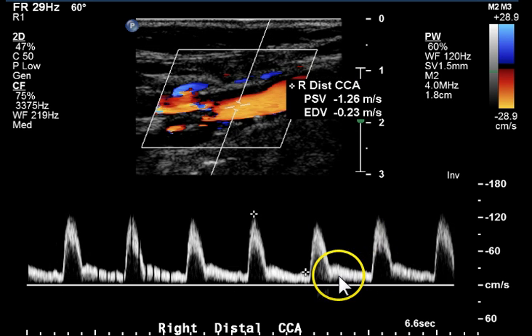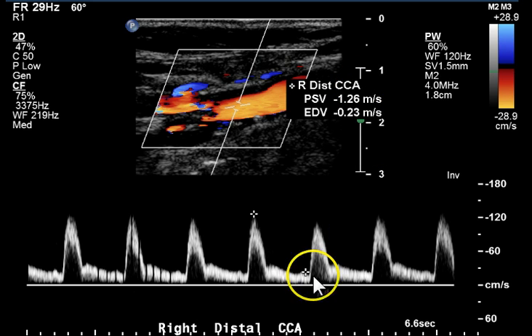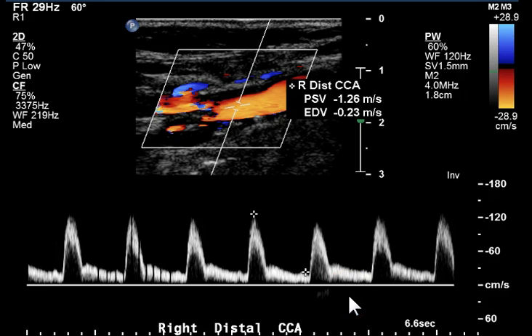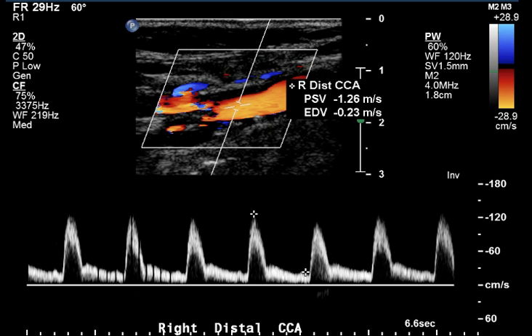Another image of the waveform. In this case, we're seeing a flow velocity of 126 centimeters per second. Remember that the criteria we use for diagnosing disease in the internal carotid artery do not apply to the common carotid artery. This is a normal velocity for this artery.